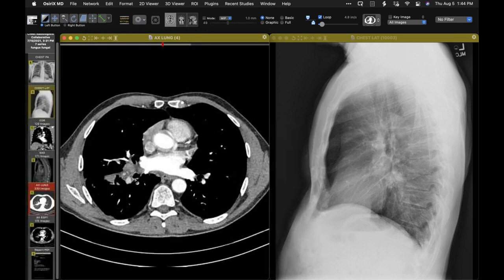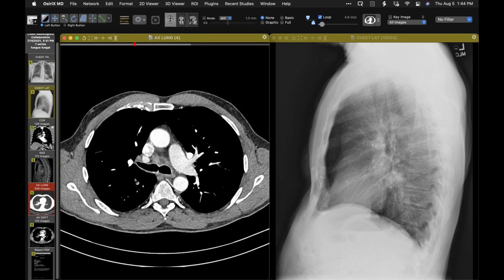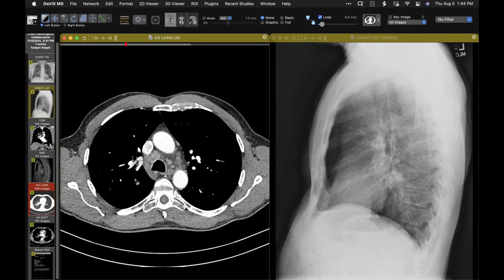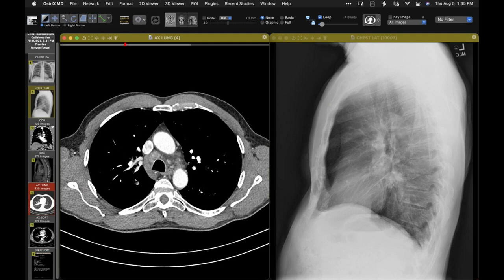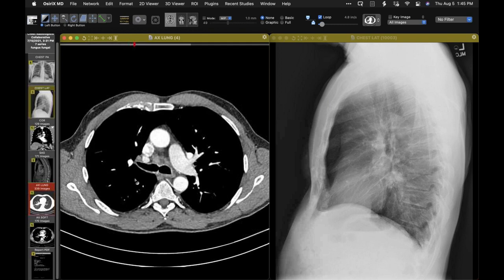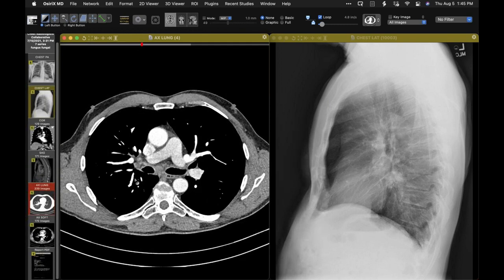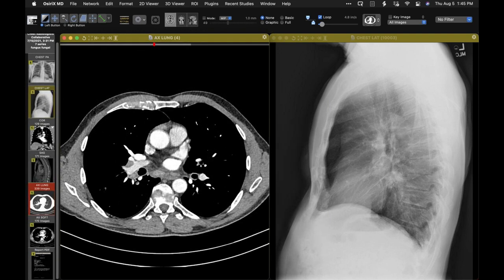It's actually quite a bit of lymphadenopathy for cocci. It is a lot, isn't it? It's generally pretty mild. And the interesting thing about cocci is you don't see much in the way of residual calcified nodules. Sometimes you'll see one small nodule, but it tends not to leave behind very much compared to, say, histoplasmosis, which likes to leave behind lots of traces, you know, calcified nodes, calcified nodules. Right. Yeah.